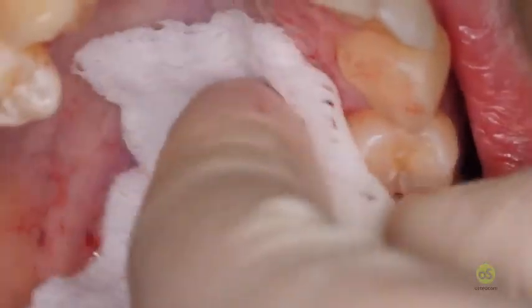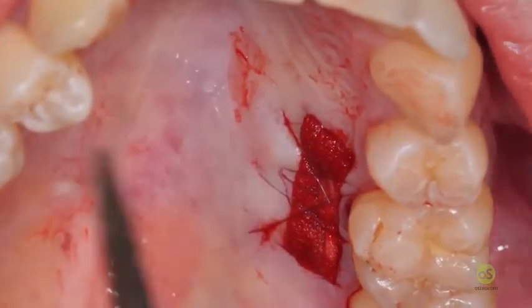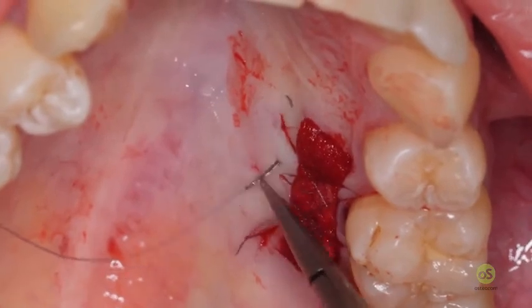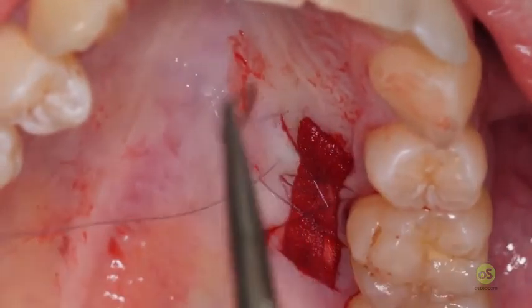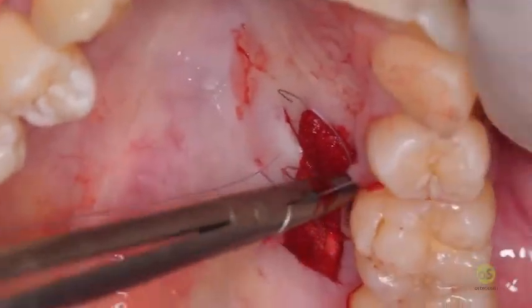This is more than enough. You can also make another one, but it's really not necessary, just to give a better stabilization to the collagen sponge in an area where the palate is very, very soft.